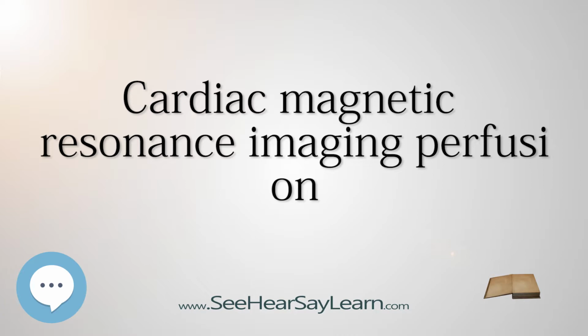In an abnormal scan, an area of the myocardium will turn gray slower than the surrounding tissue as the blood, and hence gadolinium, enters more slowly due to a narrowing of the coronary artery supplying it. This is called a perfusion defect and usually represents myocardial ischemia.